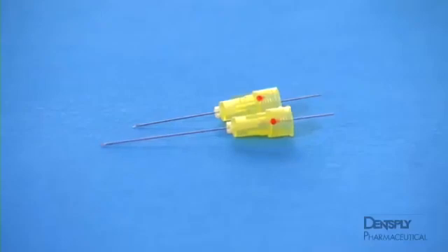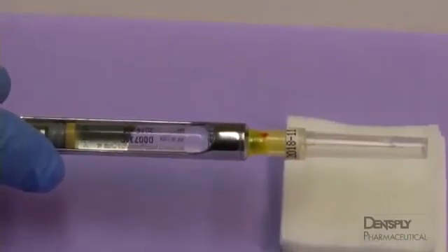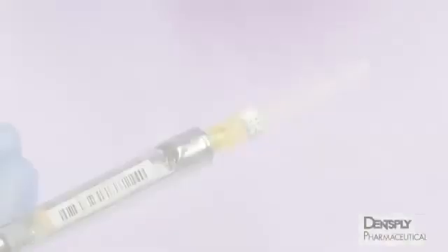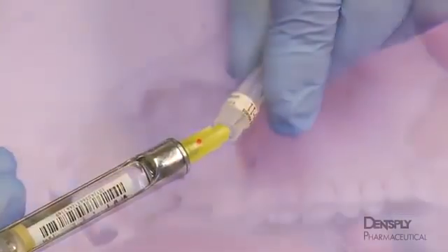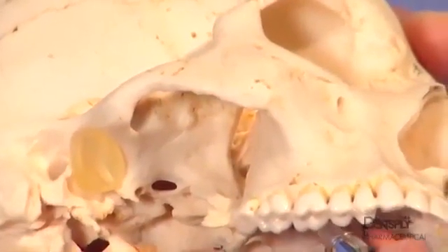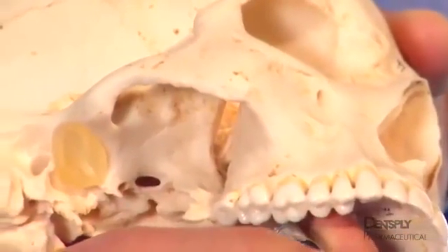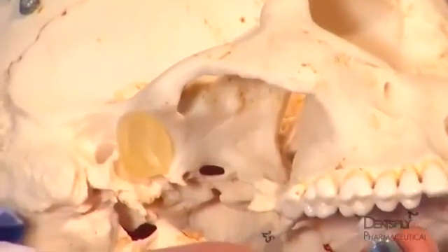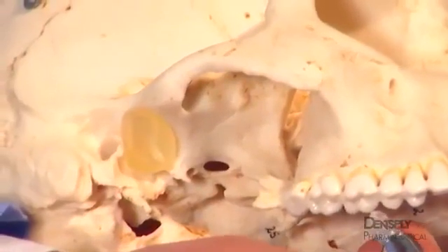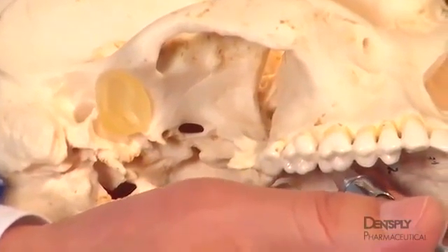For this injection, a 27-gauge long needle is preferred. The smaller diameter and greater flexibility of the 27-gauge needle facilitates passage through the canal. With the bevel facing down, the needle is bent upward 30 degrees at the hub. Then, as the needle is inserted upward and backward through the greater palatine foramen, the heel of the bevel will tend to contact the posterior wall of the pterygopalatine canal, allowing the needle to deflect anteriorly. Should the needle tip strike bone, there is a likelihood that it cannot be advanced and must be redirected.